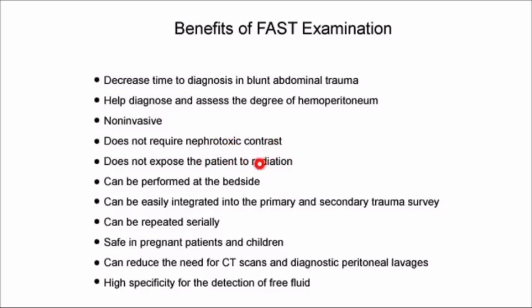Of course, it's a non-radiation emitting procedure. It can be done bedside in the emergency room setup. The repeatability is good, and it usually can be integrated in the primary and secondary trauma survey of the patients. Okay, in pregnant patients, it's very useful because of the non-radiation emitting procedure.